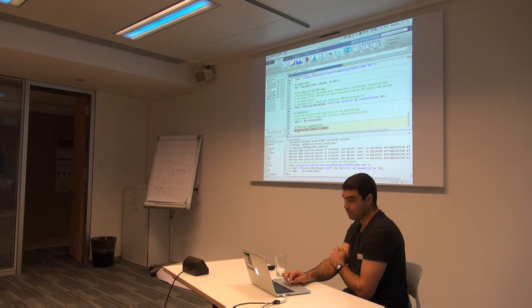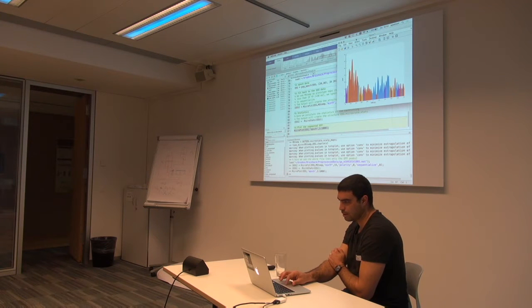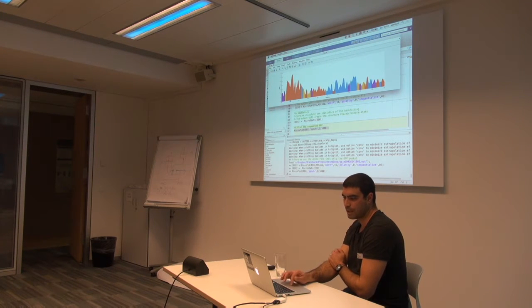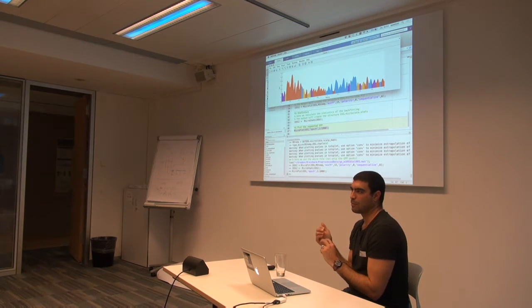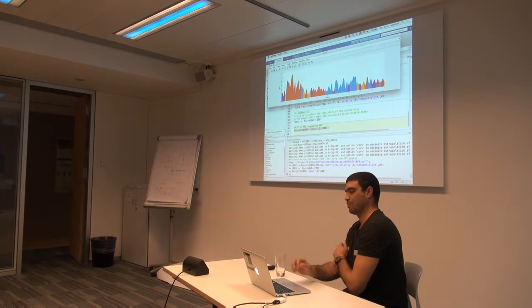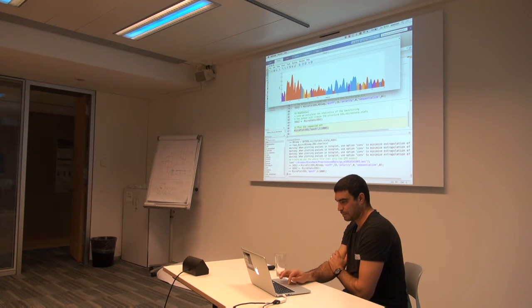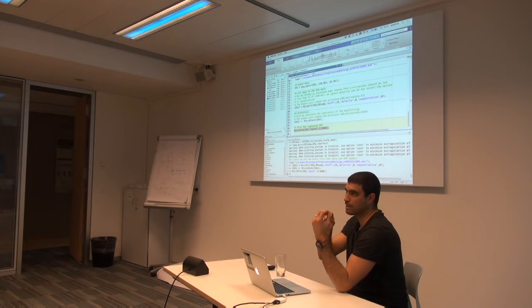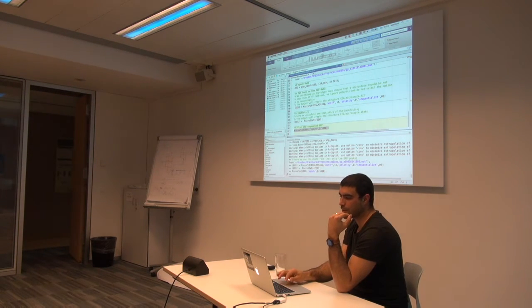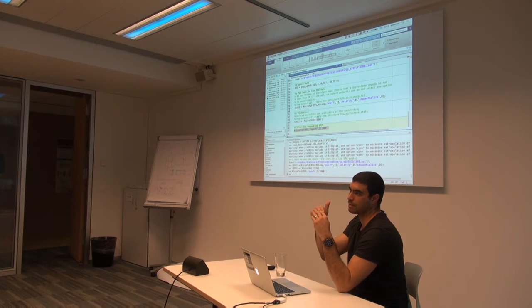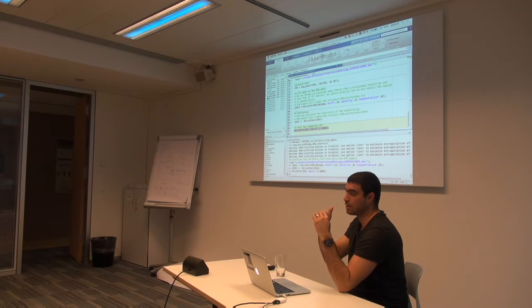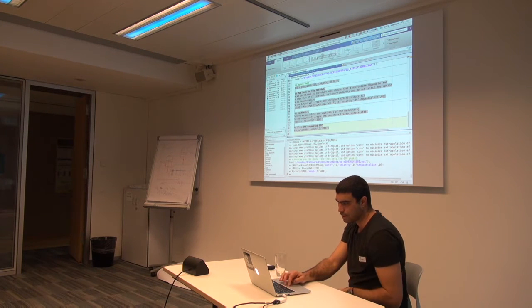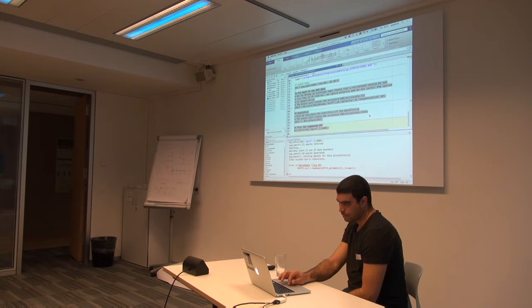We can also look at the segments visually over some time — I've chosen 1,000 time frames. With this visual inspection, we see whether the microstates sort of look as they should. These functions all work for single trial data, so an ongoing EEG signal. But we can also use them with epoch data. If we have many trials for the subject, we can rerun EEG pop epoch at the end.